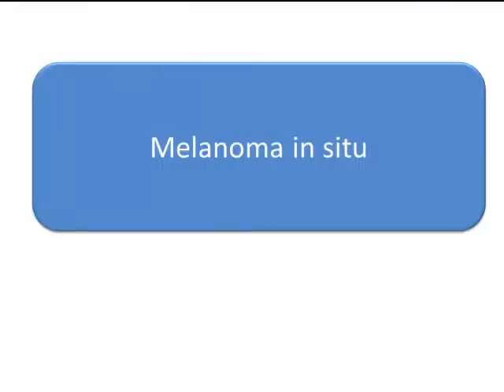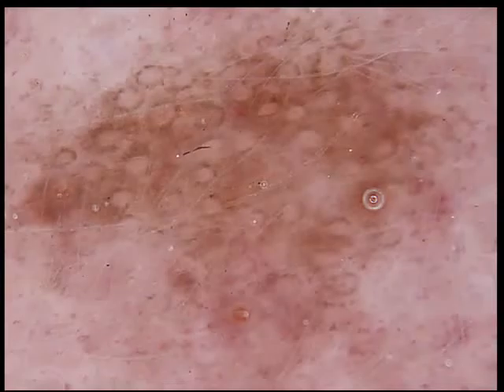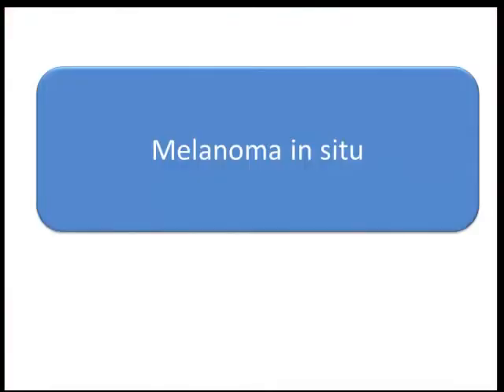On the face — melanoma in situ. Here is another case, clinically difficult to differentiate lentigo maligna from pigmented actinic keratosis or even solar lentigo. Dermatoscopically, you see circles, mainly gray circles, which means there is a lot of pigment within the follicular epithelium. This indicates, if there is only a pattern of circles, early lentigo maligna melanoma in situ.